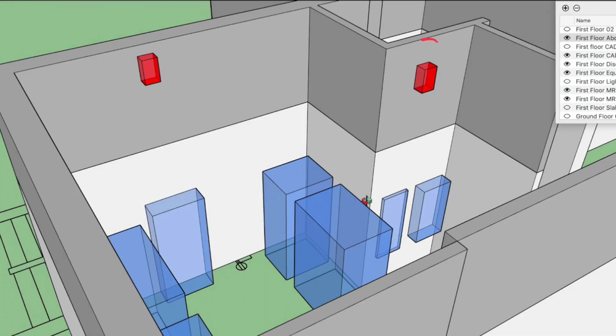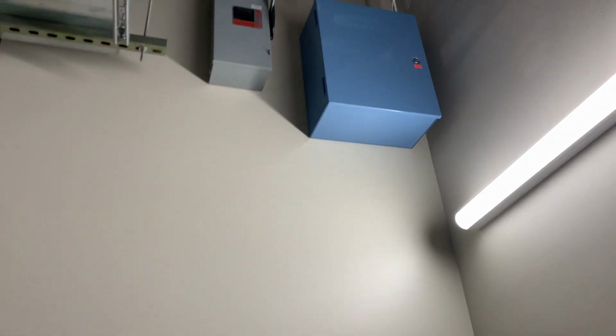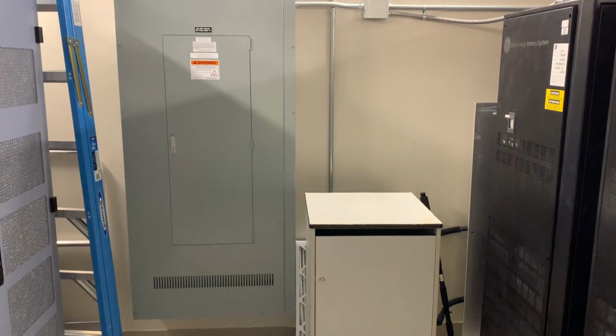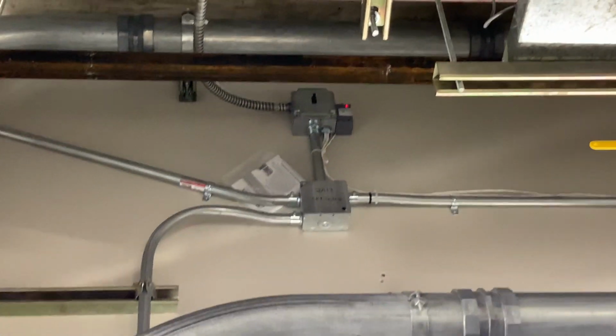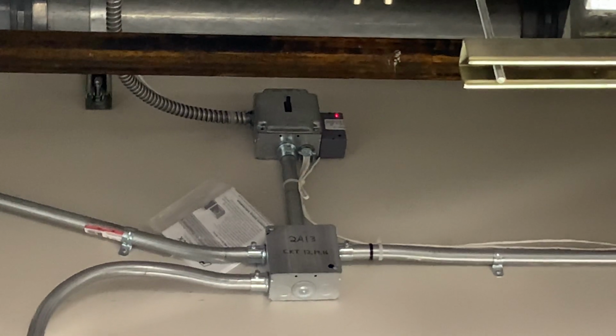If a maintenance or facility personnel were to come in, on their right, they would find the first disconnect. In the event that this disconnect is tripped, please locate an electrician on site or facility maintenance. On the other side of the wall to the right, you'll find the second disconnect. This is a 20 amp disconnect for the fresh air intake. Again, if it is tripped, you can always locate a facility electrician for further investigation.